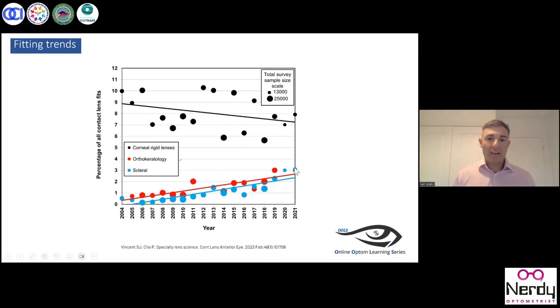We also know orthokeratology is good because people can wear those in their own environment at night and then be free of lenses during the day, when they are in maybe some of those environments that are not as contact lens compatible.